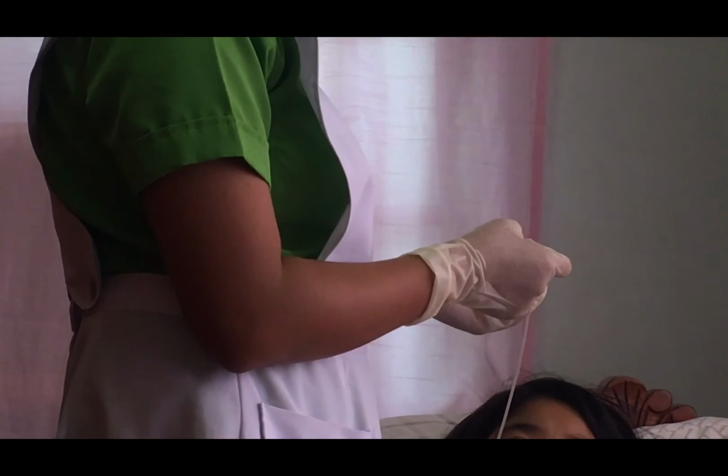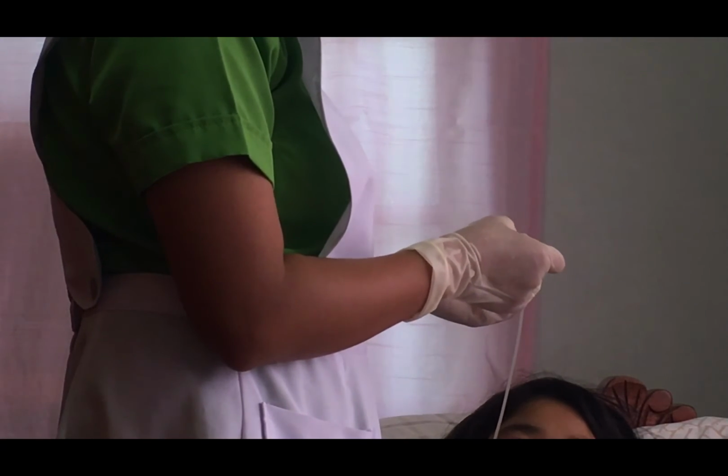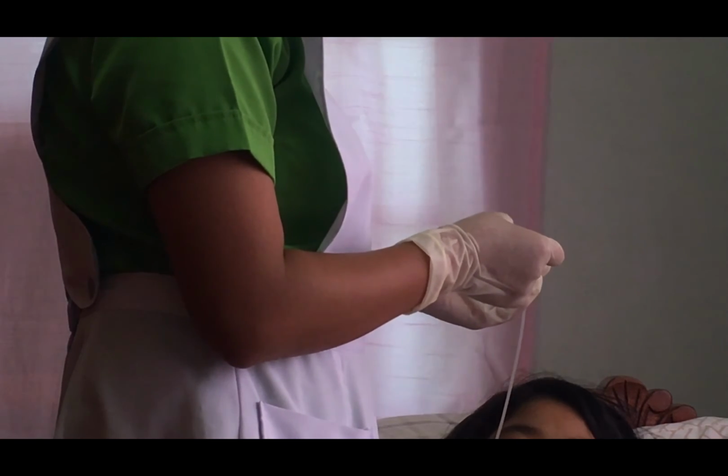Check for the placement of the nasogastric tube by attaching a syringe on the free end of the tube, then aspirate gastric contents. The pH level of the gastric content that was aspirated should be below 6. For better assurance of the placement of the tube, we need to obtain an X-ray before instilling any feedings or medications.